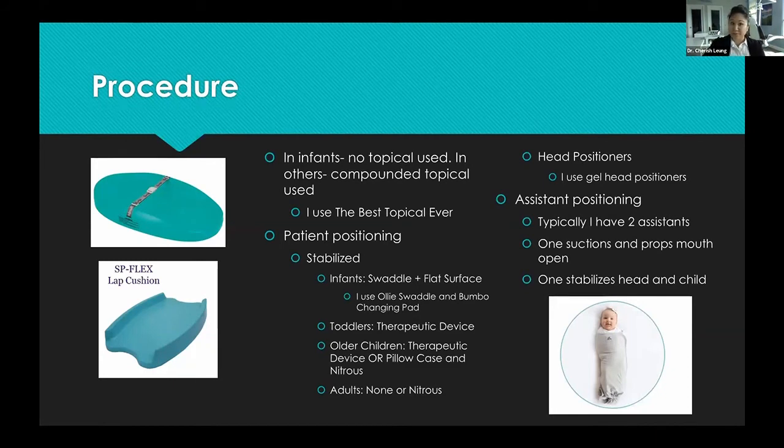So in infants, I don't use any topical because they're so tiny. Sometimes, like I said, they're a week old. You don't want to use any stuff, especially if you don't know if they have reactions to anything. So no topical. It's fine. It doesn't hurt. I've done it on bigger kids with no topical either. But in bigger kids or adults, you can use the compounded topical. And like I said, I use the best topical ever. That's what it's called. I'm not just saying that if you've never heard of it before.